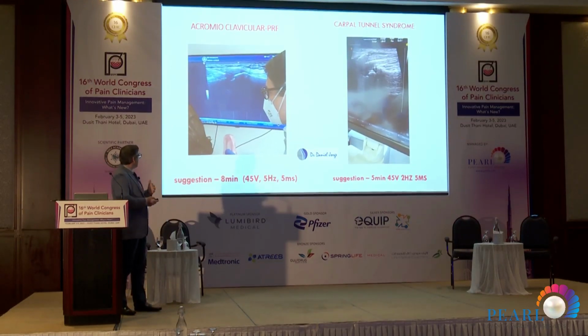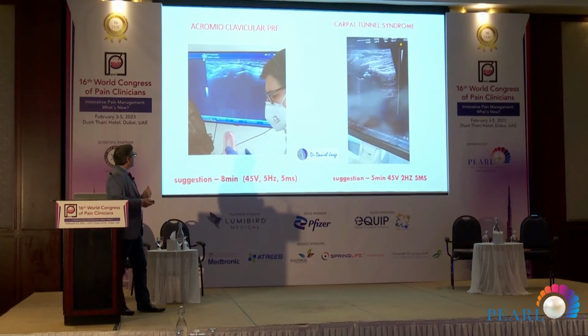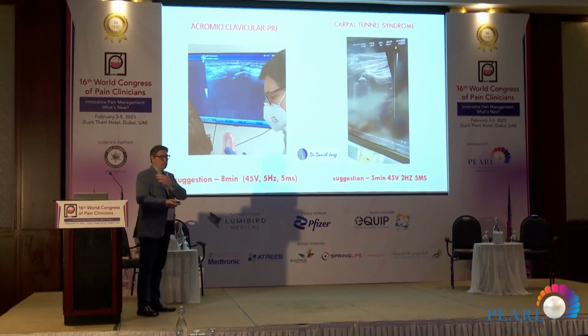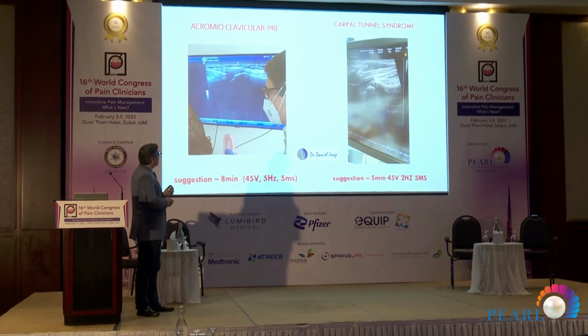And other more simple procedures like the acromioclavicular, we know that it's a usual complaint of patients from arthrosis, and it's quite easy to do, it's superficial. You can go inside of that joint guided by the ultrasound.